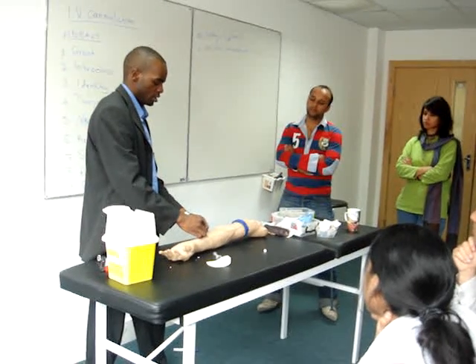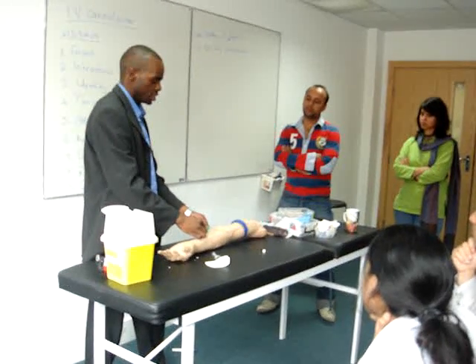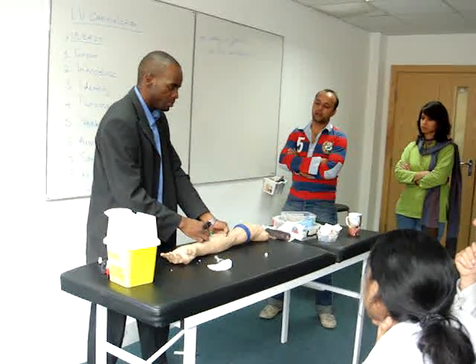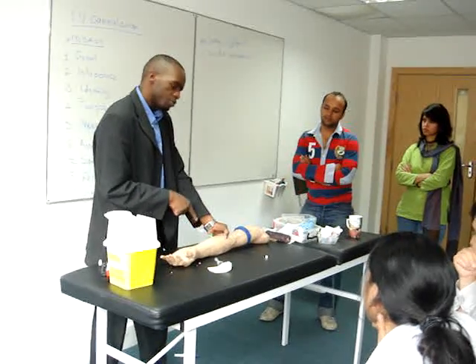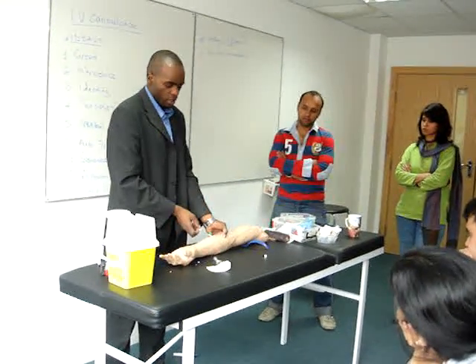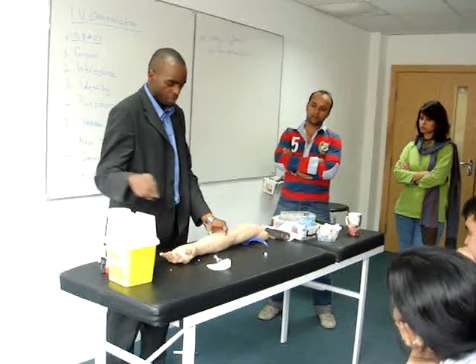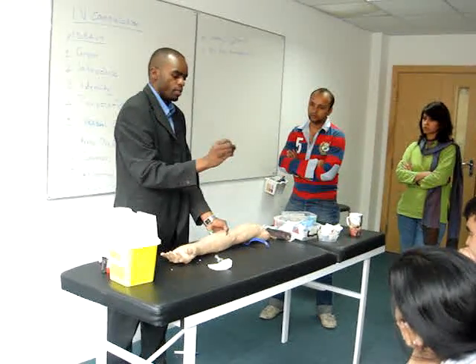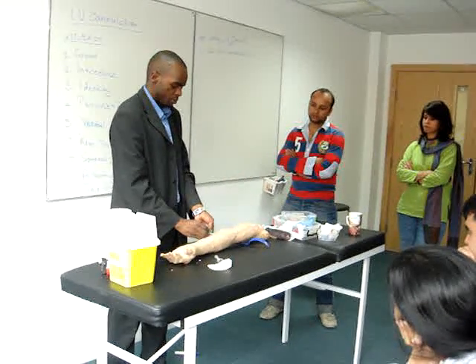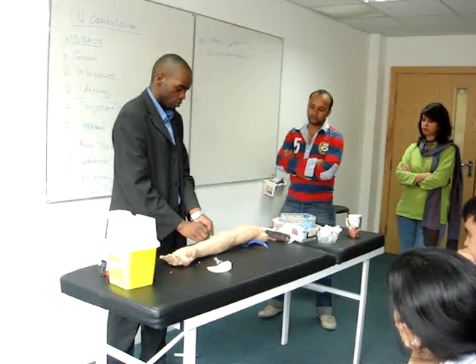Go ahead. Then you push the rest of the cannula in, to make it easy, inside. And then press. Prevented blood flushing back. Don't remove the needle. It is there. Put it there — because when you come and remove the needle, put the sharp end in. And this, put there. Don't need this hand anymore. Come and stabilize. Put it there.